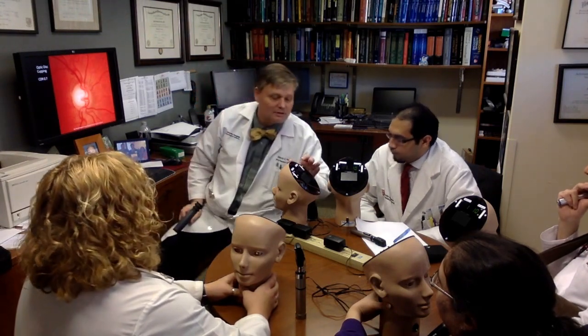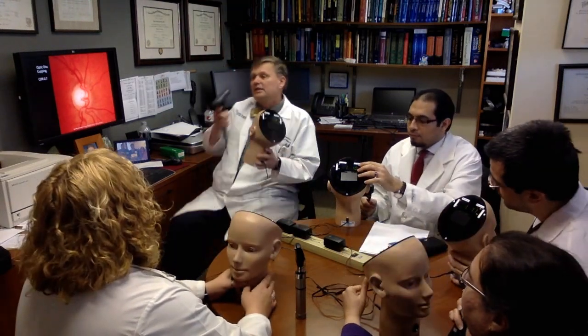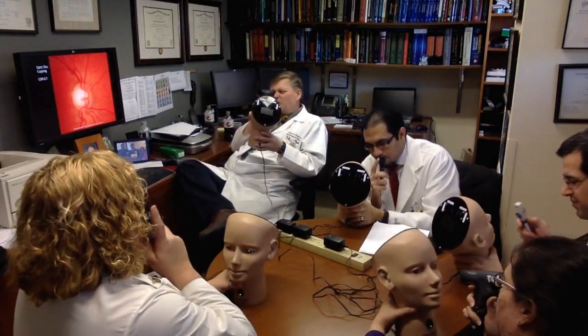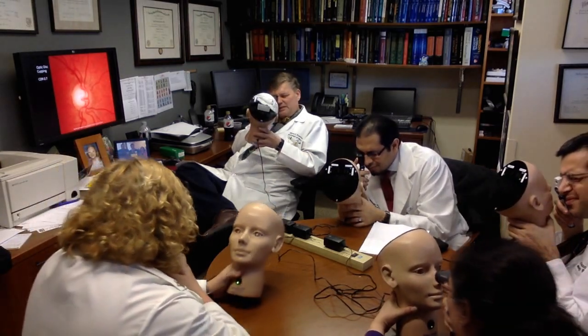Now, let's go to number 11. Hit number 11. Same story. Focus about 10 feet away. Now come in at about 15 degrees. You see a red reflex.